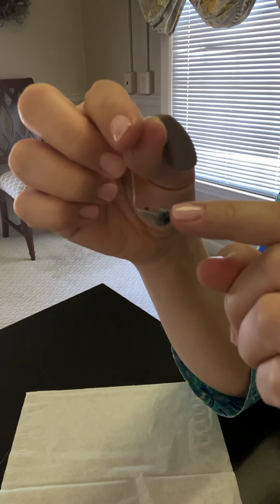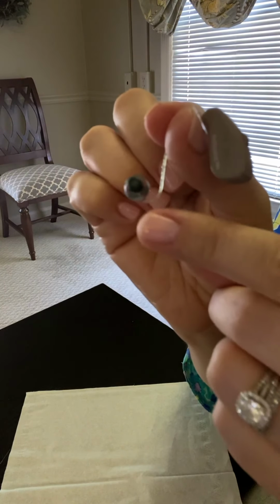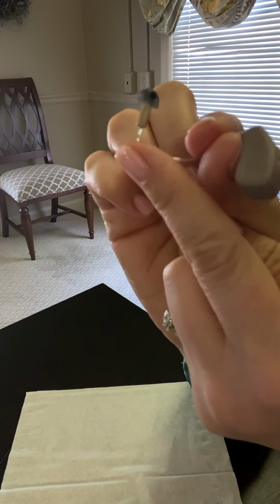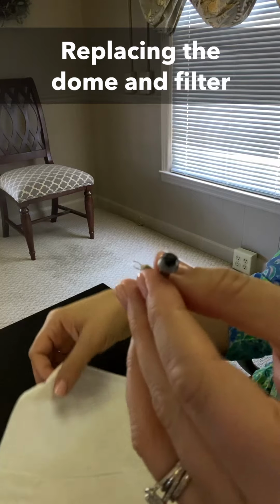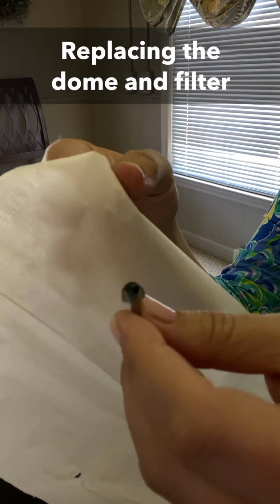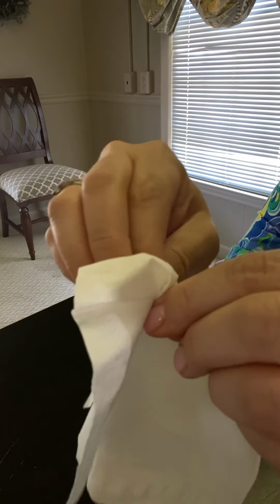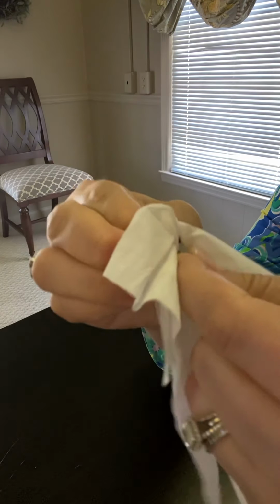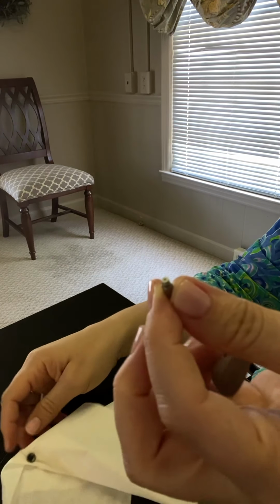So I'm going to show you how to replace the dome and the filter. The gray piece, the little cup, is the dome. Wax collects in there, so it's really easy to replace it if you want to. I think it's easiest to grab a tissue and use it to grip that dome and then just pull it off. You might have to work it back and forth a little bit, but the dome comes off.